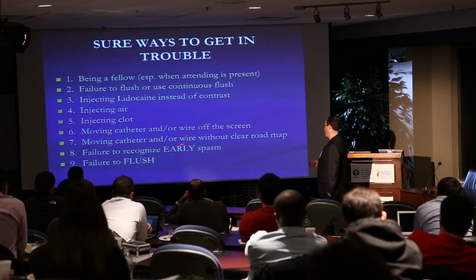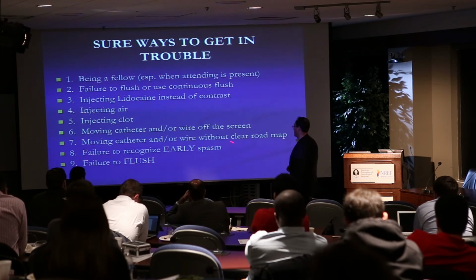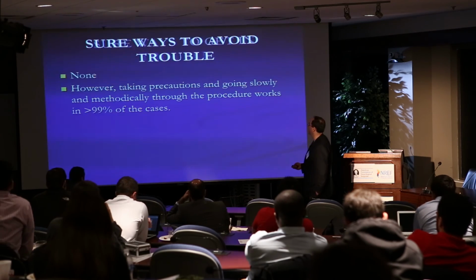Moving the catheter or the wire without a roadmap and not knowing where you're going. Moving things where there are things off the screen, obviously an issue. And failure to recognize, I would say, not only spasm, but any problems that are going on. And failure to, like I said, keep those things clean and open.